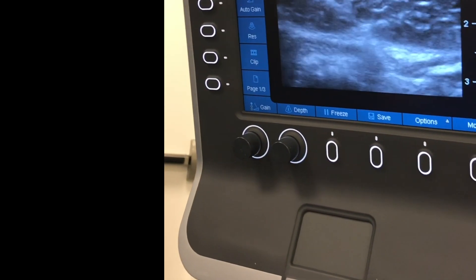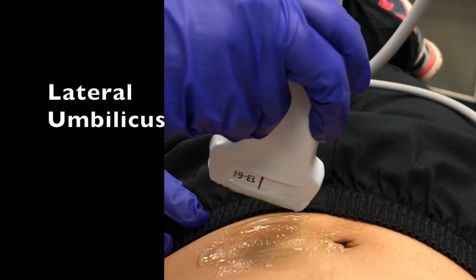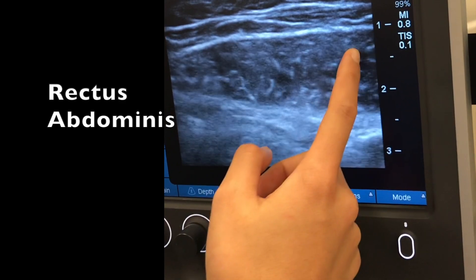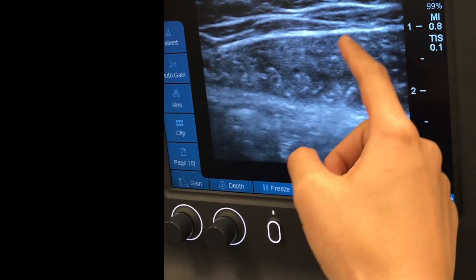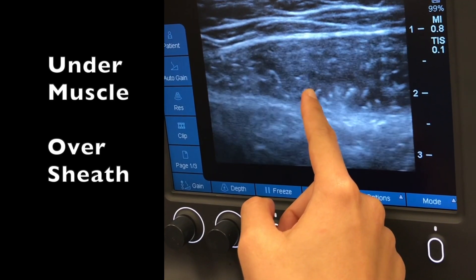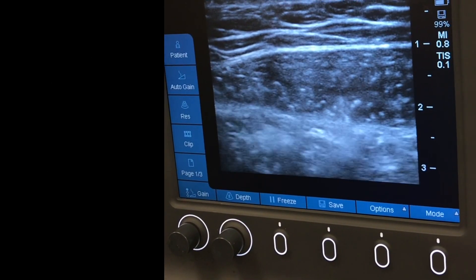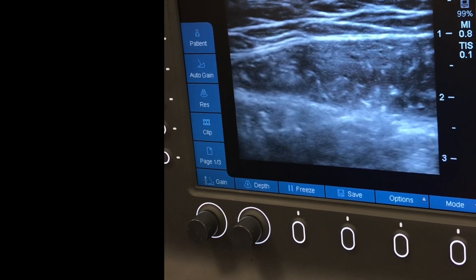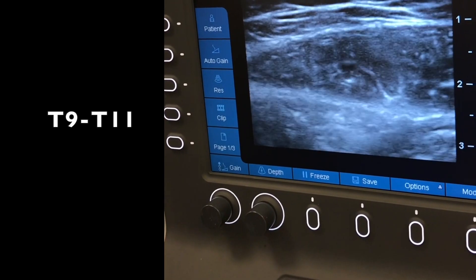Now we're doing the rectus sheath block. Melissa is controlling the ultrasound to find my rectus abdominis muscle. The probe is placed lateral to the belly button. We can see the rectus abdominis muscle with the anterior sheath above it and the posterior sheath below. When doing the block, you want the needle to go underneath the rectus abdominis muscle but above the posterior sheath. Inject one to two mils of local anesthetic and you should see the tissue layers spread, confirming correct placement. This block is great for umbilical surgeries, covering T9 to T11 dermatomes.